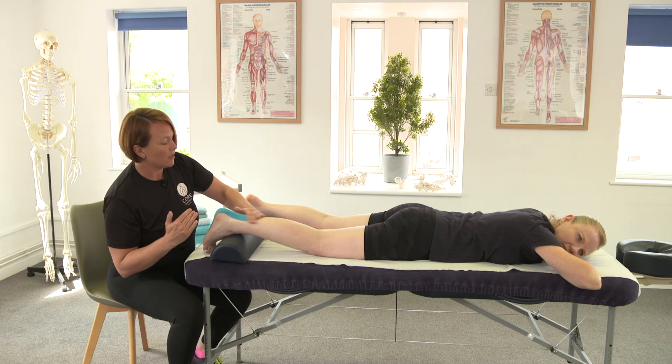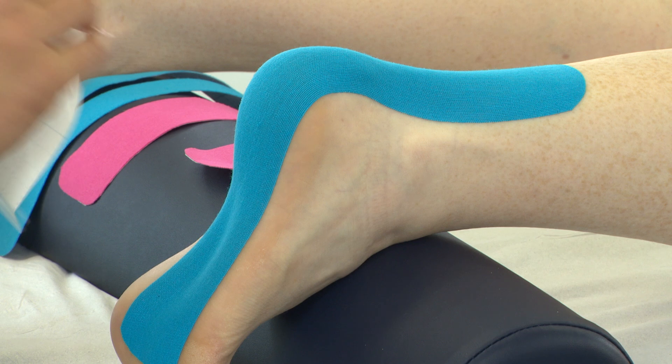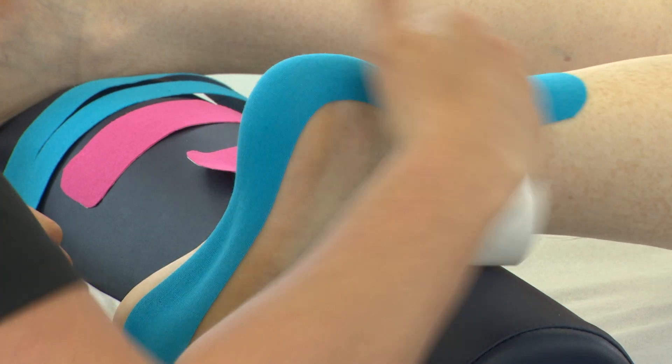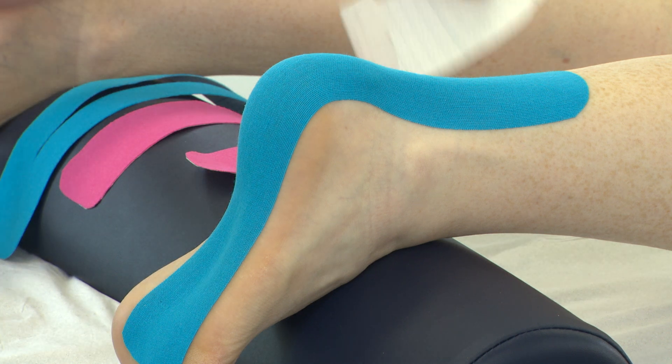You can use your fingers to stick the tape down, or you can use the back of the tape. The heat activates the adhesive to ensure all the area is stuck to the skin.